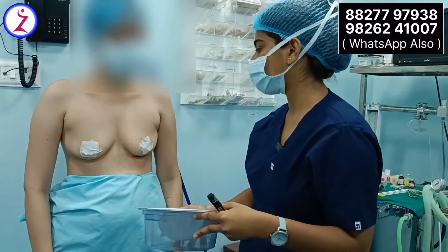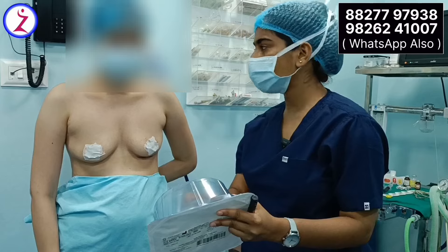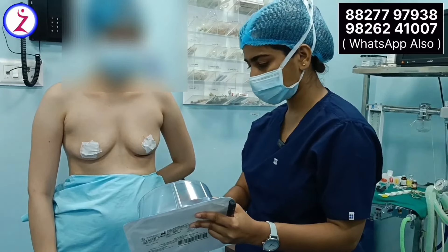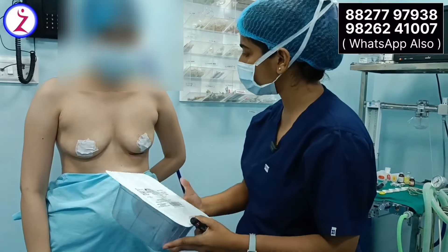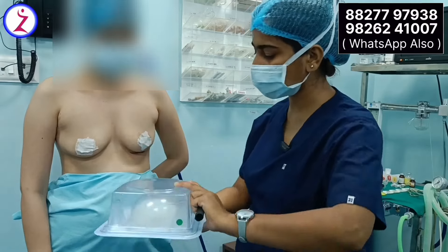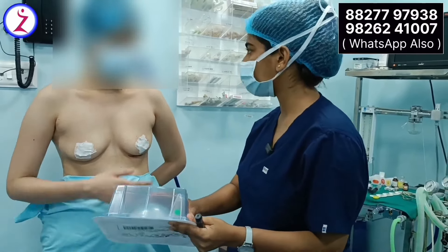In this case, we chose a 280cc implant which will look natural and not look heavy, and she will be comfortable with it. This implant is from a company which is an FDA-approved brand of very high quality, meaning there will not be any chances of infection or complications in the future.